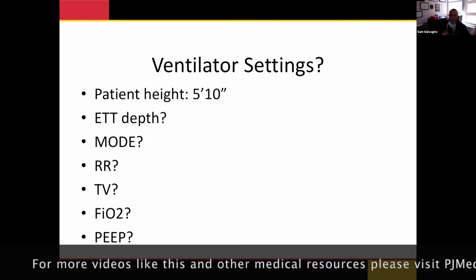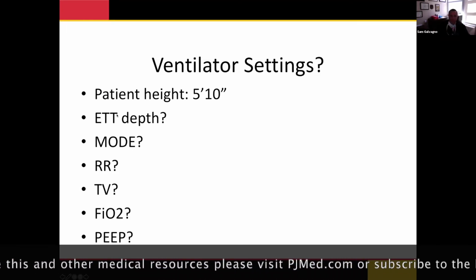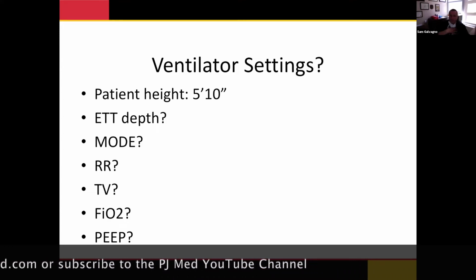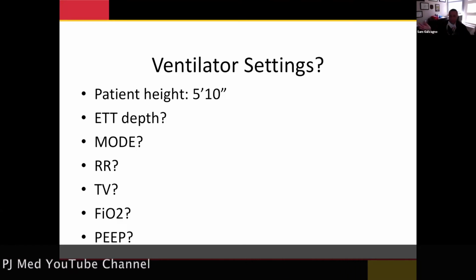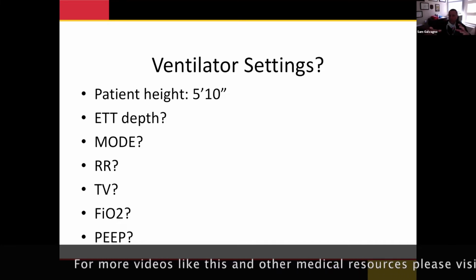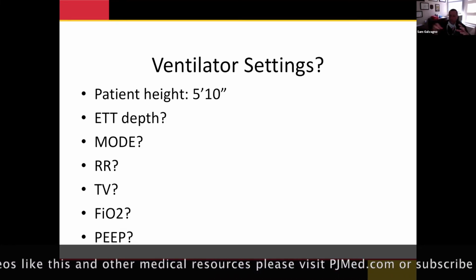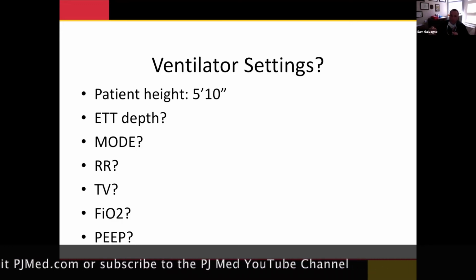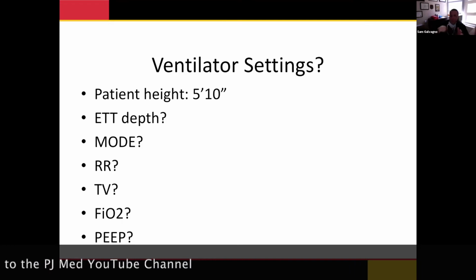Let me just back up. I added one more thing, endotracheal tube depth. This is one thing I've been doing on all my intubations. So before I go in the room, I will pre-brief it with my team as we're putting our PPE on, and we will pre-brief the endotracheal tube depth. Why? Because I would argue you're not going to be able to get 8 million chest x-rays to make sure your tube's in the right spot. B, you don't want to main stem these patients. You don't want to put the ET tube down the right side of the chest where it usually goes if you shove it in too far. We want to get this right in the first chance we got.